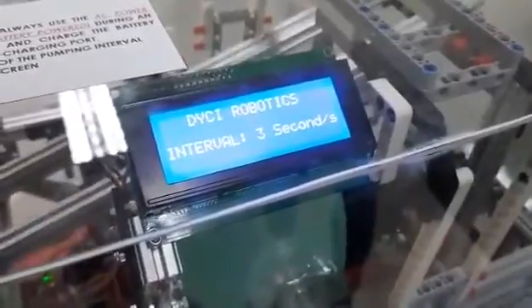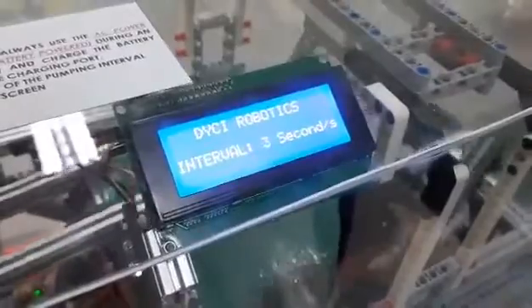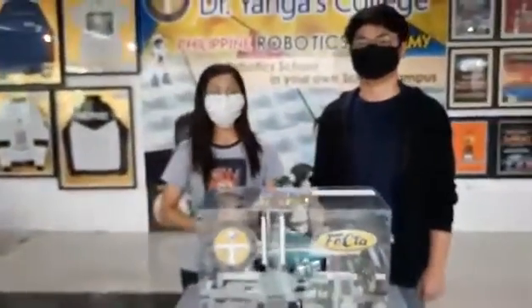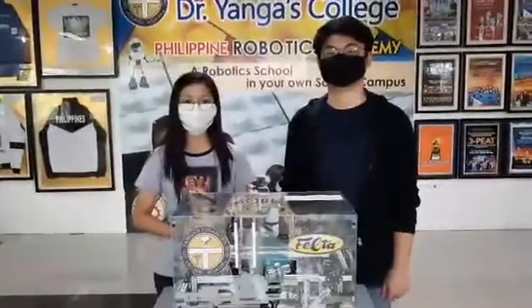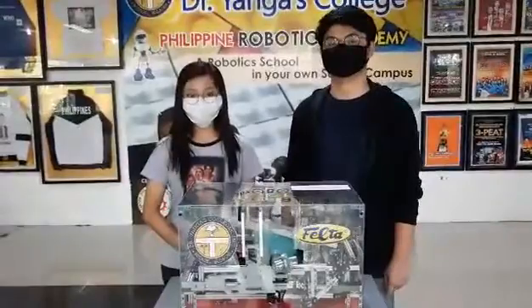This robot may be used with batteries or AC power. We hope that this humble invention could inspire other people to continue using technology to help others.